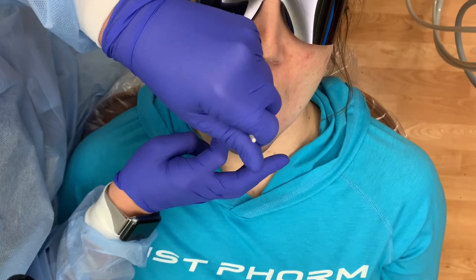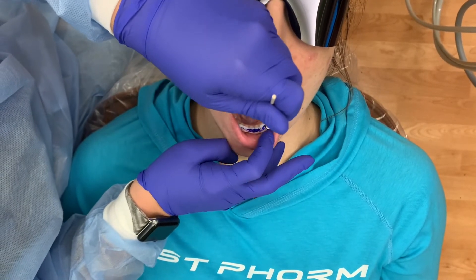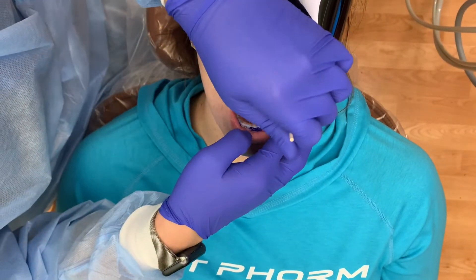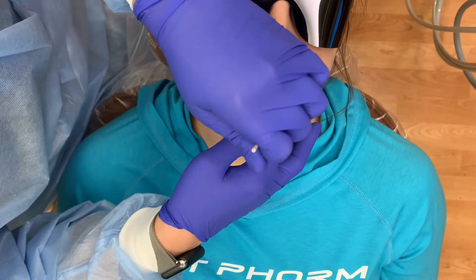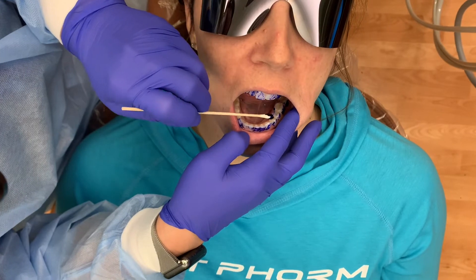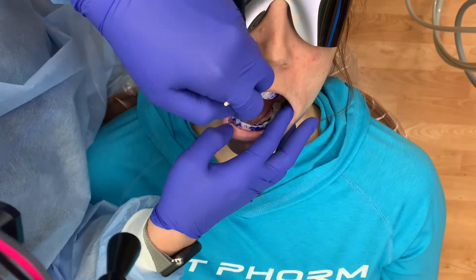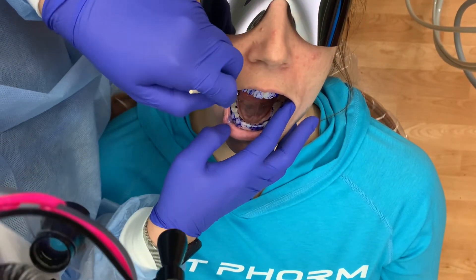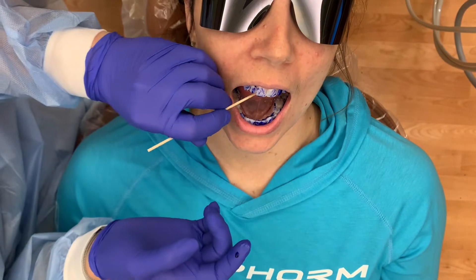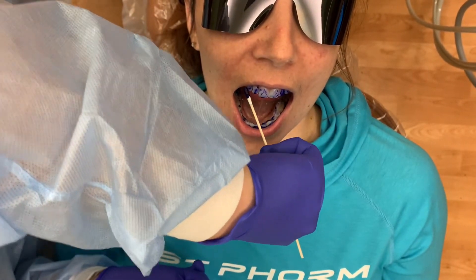By using the Tri-Plaque ID Gel, you can identify the plaque by observing the color of the stain. A pink or red color on the tooth surface indicates fresh plaque accumulation. A blue or purple color indicates mature plaque that is at least 48 hours old, and a light blue color indicates mature and strong acid-producing plaque.